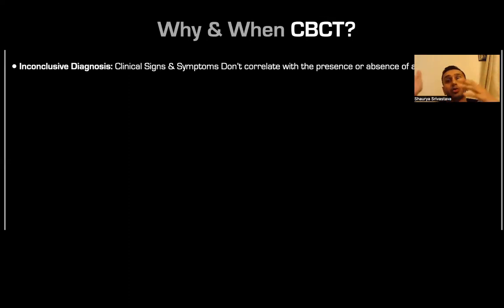You may have signs of apical periodontitis but can't see it on a radiograph, and you start to ponder, is it that or is it this? There's a lot of clinical testing that goes along with it to consolidate a result before you refer for a CBCT.